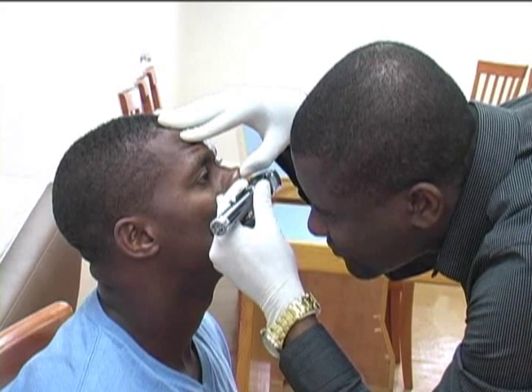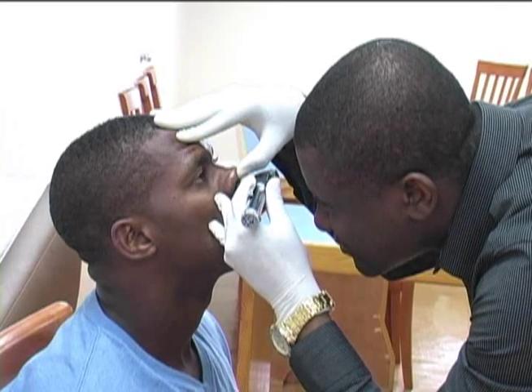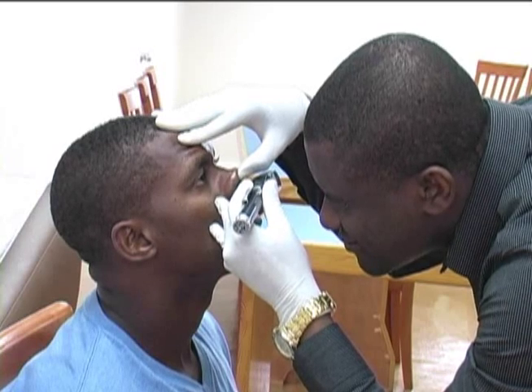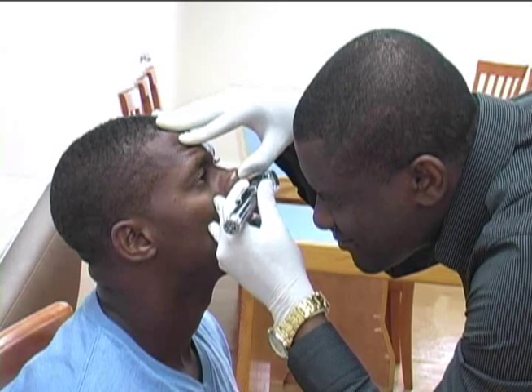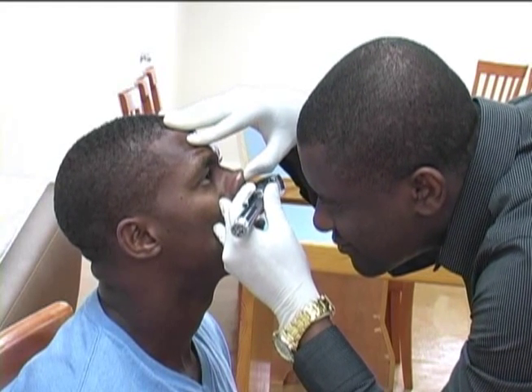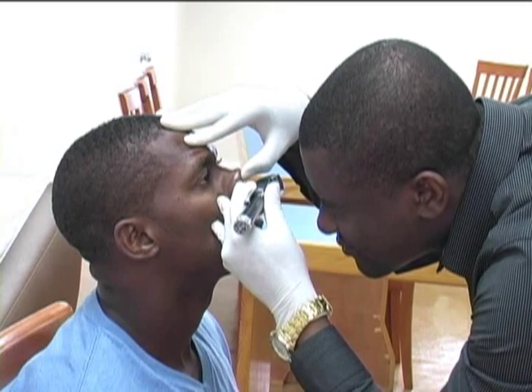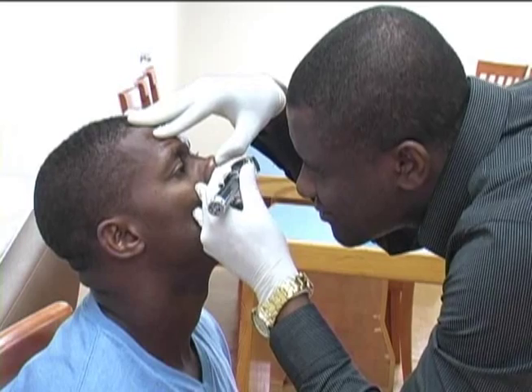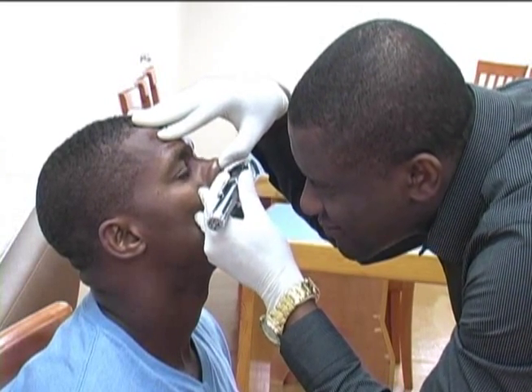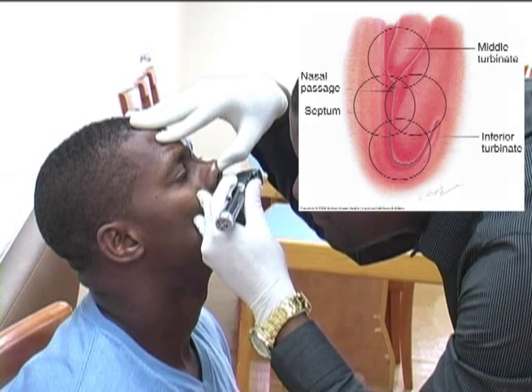Observe the lateral wall for color, size, and quality of mucosal lining. Look for discharge. Note the amount, color, and consistency of any discharge. Observe the conchae. To visualize the middle concha, tilt the patient's head upwards and backwards at an angle of 45 degrees. This maneuver brings it into clear view. Observe for the presence of polyps or neoplasm.